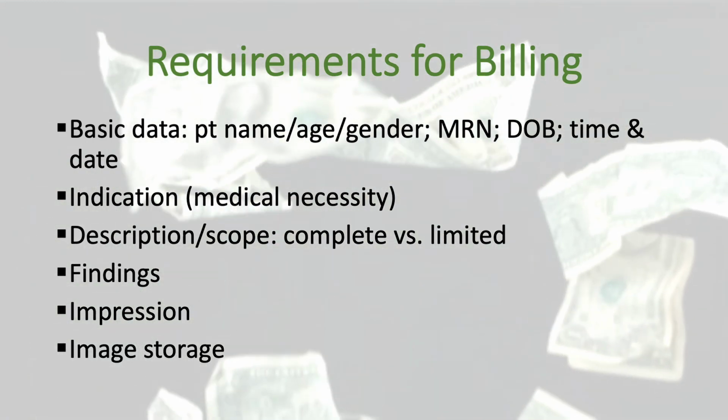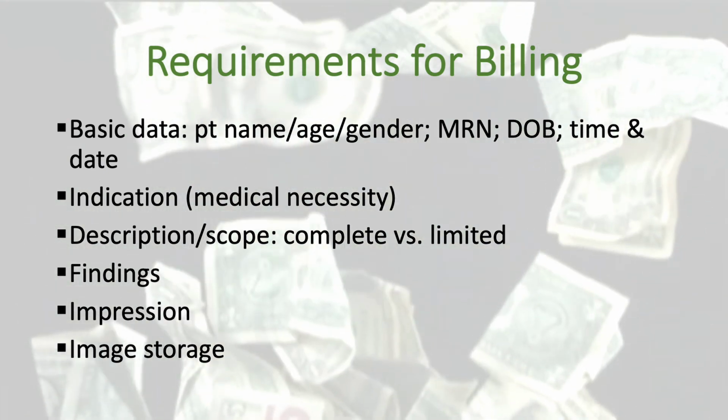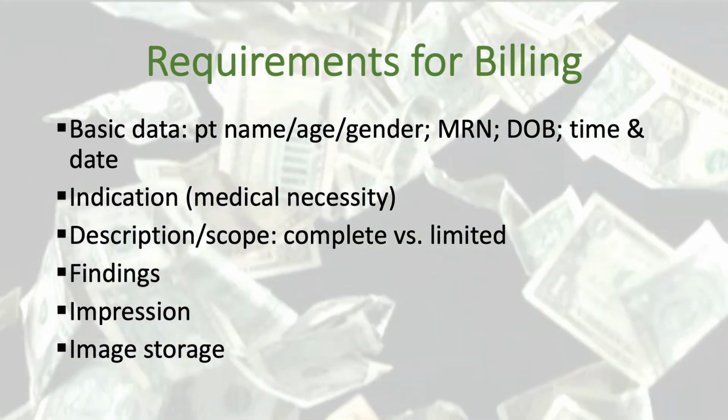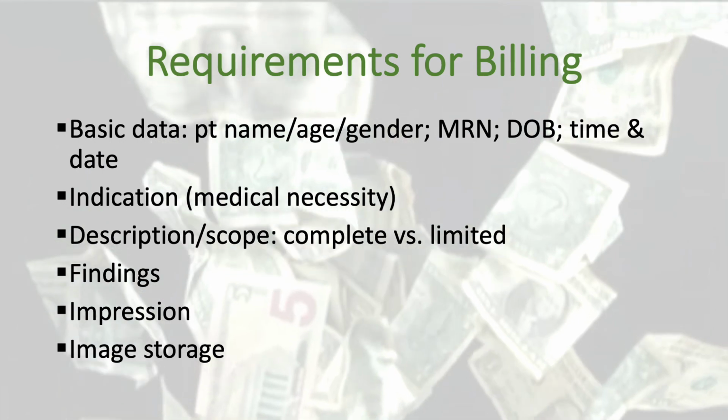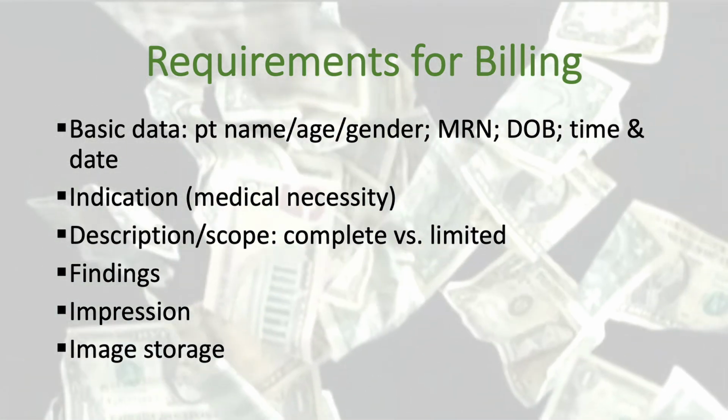And then, of course, it's very important that you make sure that your image is actually stored somewhere, so that in the future, if anyone wants to review the image, it's available in the electronic health record.